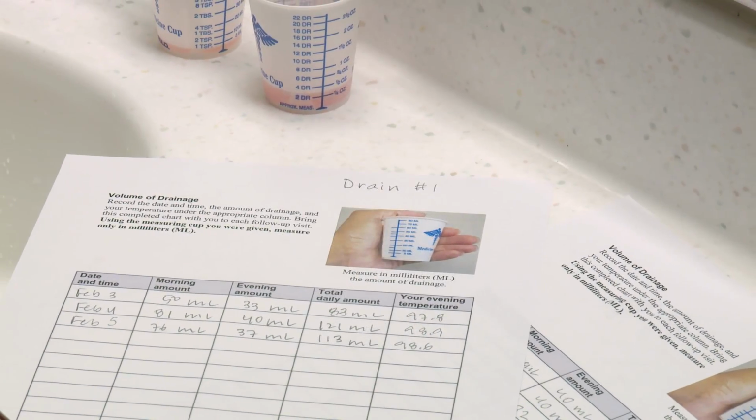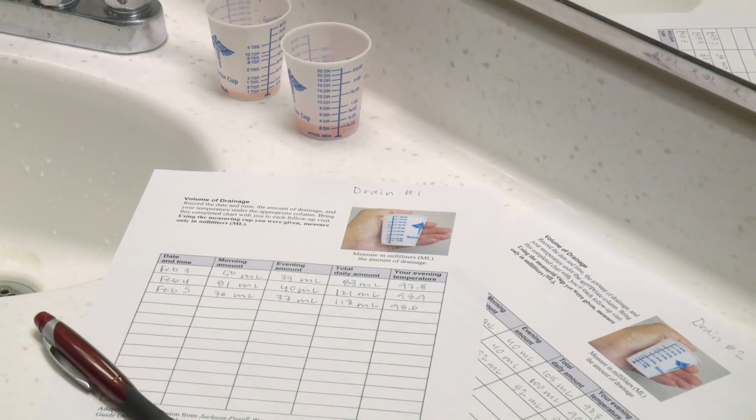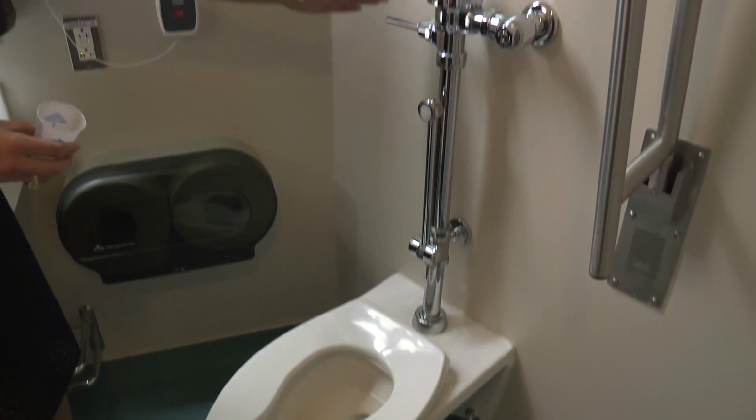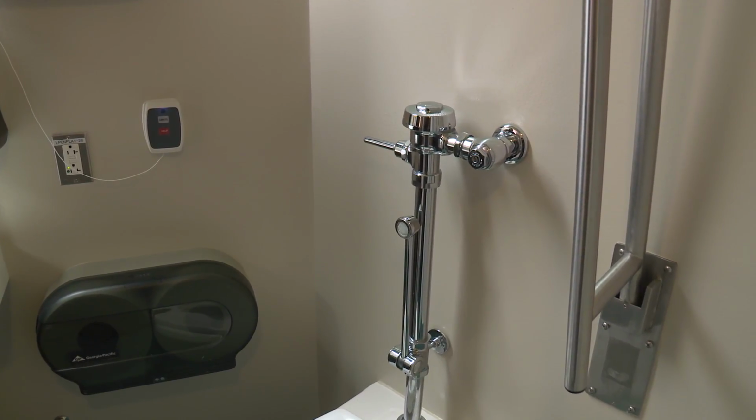Your nurse reviews your volume of drainage chart. This information is used to determine if your drains can safely be removed. After you have recorded the amount of fluid from each bulb on your volume of drainage chart, discard the fluid by flushing it down the toilet.